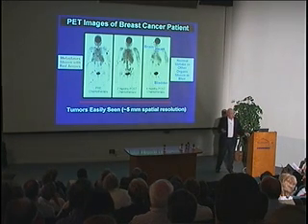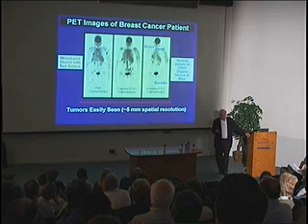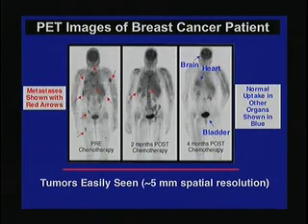And then finally, I'd like to show an example of how nuclear medicine has enabled detection of distant metastases, but more importantly, how nuclear medicine can follow the efficacy of therapy. So this happens to be an image showing the whole body distribution of distant metastases from a breast cancer. This is after tamoxifen therapy. Tamoxifen, as some of you know, blocks the estrogen receptors, and it can be very effective in some cancers.